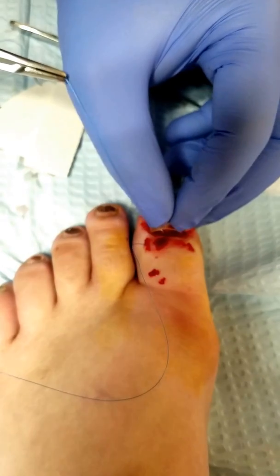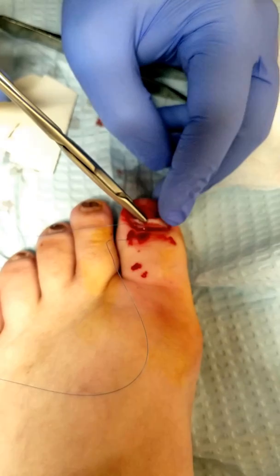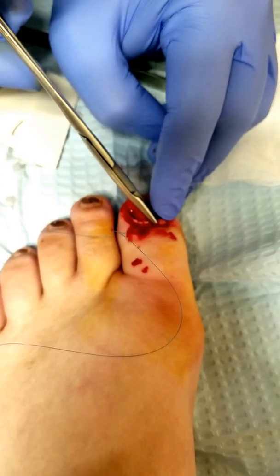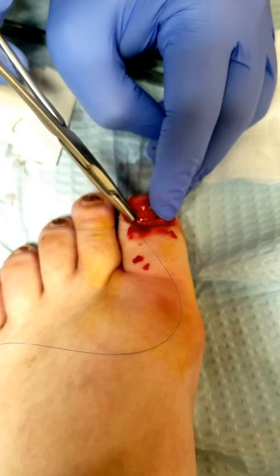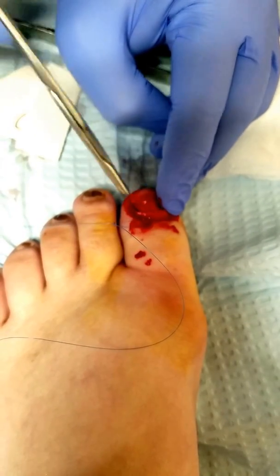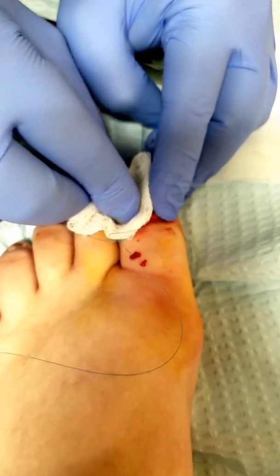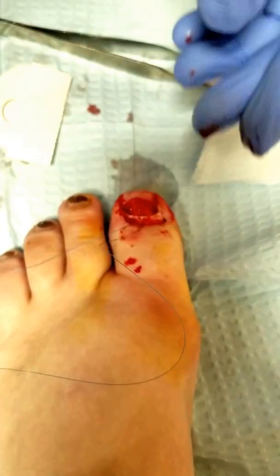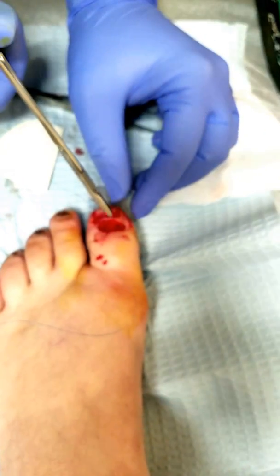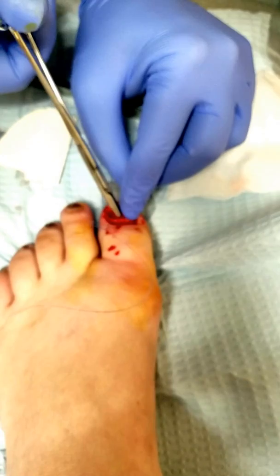A little bit of pressure. Slide this back under just to keep the matrix open so that the new nail will grow in. You alright? Just a little scared, huh? Almost done right now, though. And then the stitch will just hold everything in place in the meantime. I did the stitch through your skin — I just gotta stitch the nail back in place.